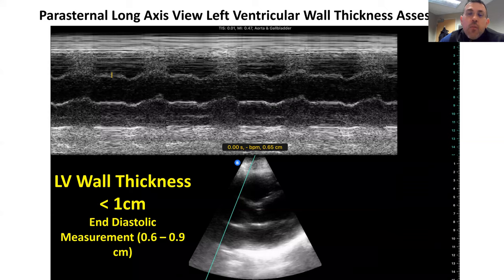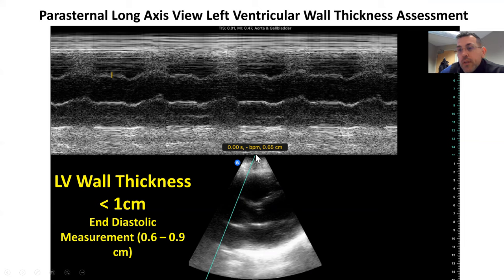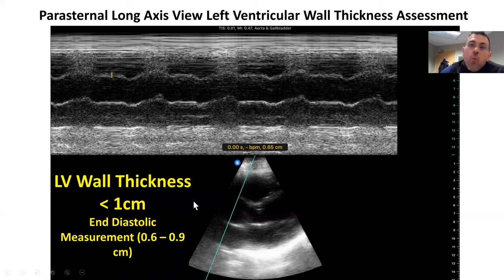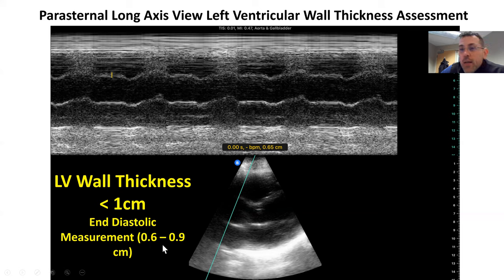Another measurement we're interested in is left ventricular wall thickness. We can do this two ways, showing M-mode first. M-mode comes down through the septal wall, and then we measure from one point of the septal wall to the other. Here this comes up as a measurement of 0.65. A normal measurement in end diastole is between 0.6 and 0.9, certainly less than one centimeter for maximal thickness.